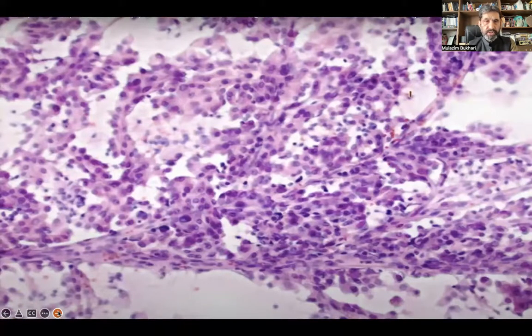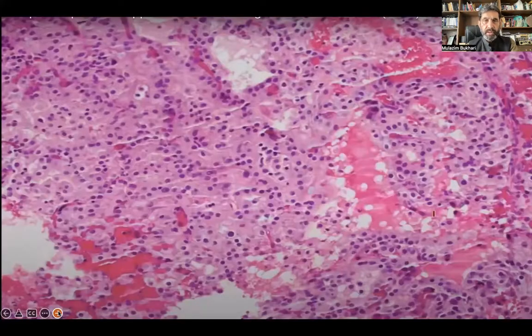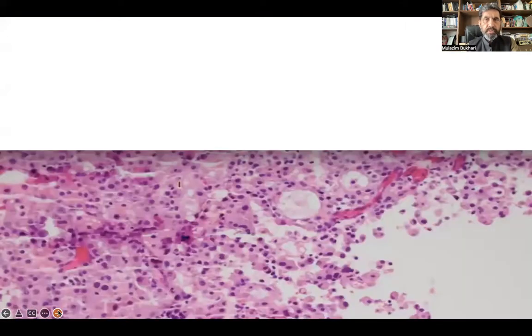Papillary structures, a stalk is there, pleomorphic cells, vacuolated cells with small microcysts, cords of cells, hemorrhages. The cells are connected with each other, with no distinct border of each cell, present against an eosinophilic background. The cells have abundant cytoplasm. Binucleations are there. So let's see the higher pictures.